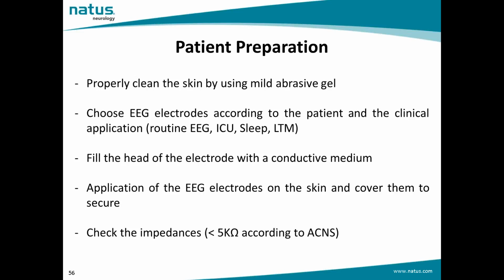The input noise consists mainly of the noise caused by the analog amplifier and by the AD converter. So, for instance, it depends on the low-pass filter, the sample rate, and the choice of electronic circuit, and it should be as low as possible.